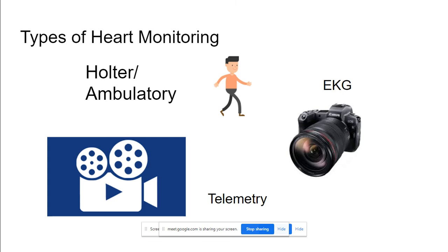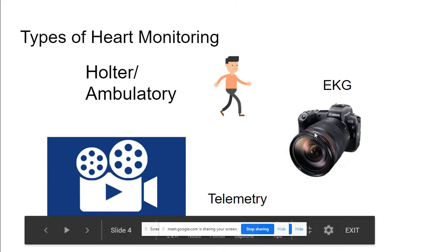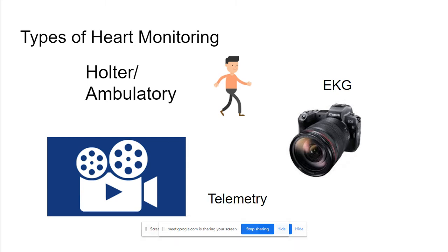That would be what we use when the patient's admitted to the hospital, but they might also have an EKG when they're in the hospital, like if the anesthesiologist wants an EKG before the patient goes to surgery to make sure that their rhythm looks good before they put them under.